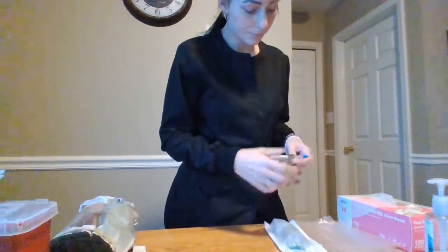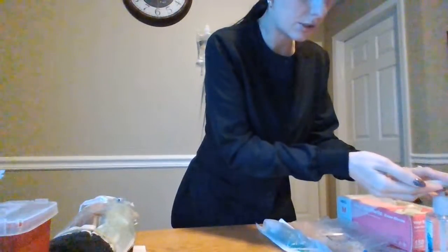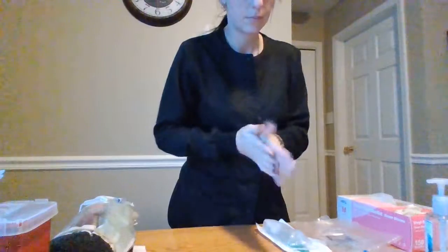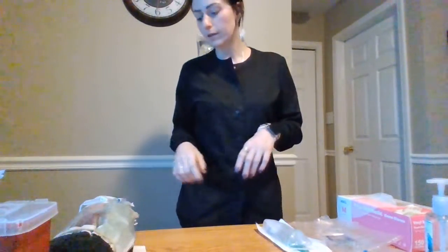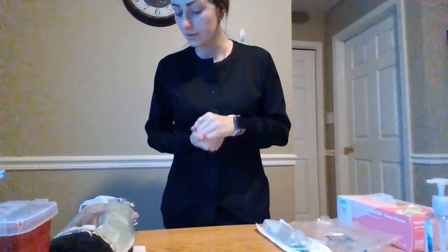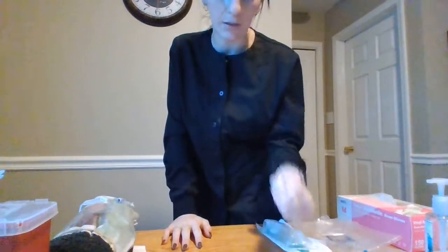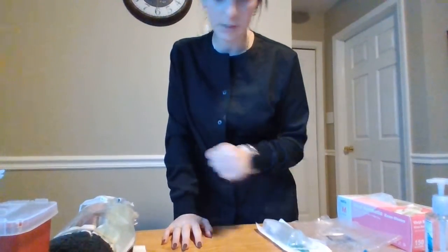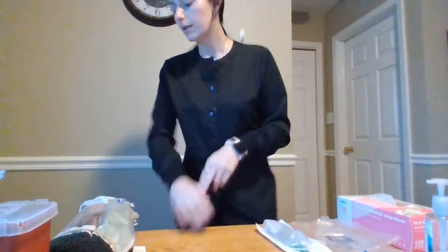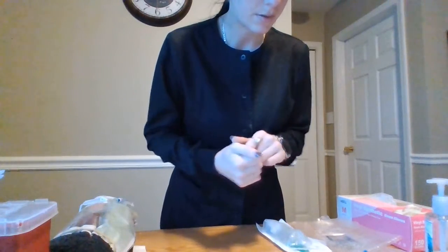I am going to perform hand hygiene. Identify my client. Two forms of identity verification. So I am going to use her name on our medication administration record, Millie Larson. Bracelet says Millie Larson, and we're going to do her date of birth on her MAR, says 1/1/1936. Date of birth on her bracelet is 1/1/1936. So that matches up perfectly.